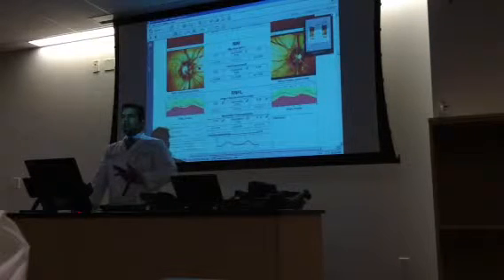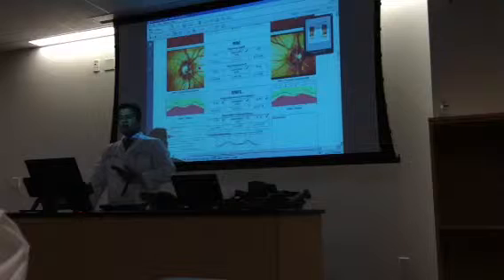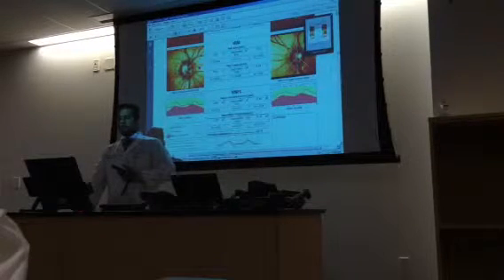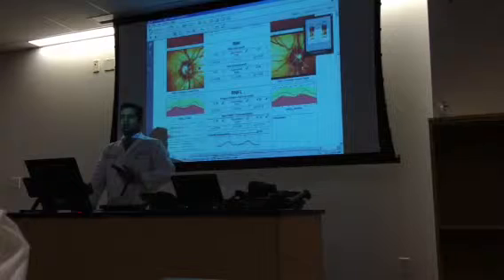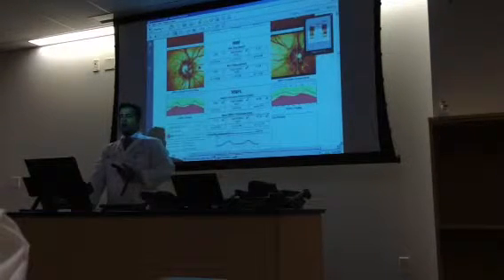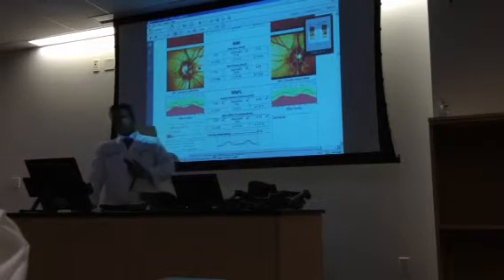The reason why HRT is not very good at measuring nerve fiber layer is because it measures nerve fiber layer just outside the disc. Literally just outside the disc, not further away. And measuring just outside the disc increases the chance of somebody with peripapillary atrophy showing false positive of potential damage.